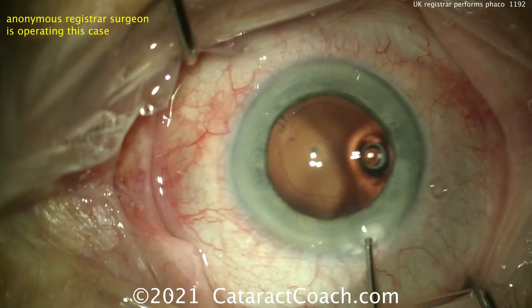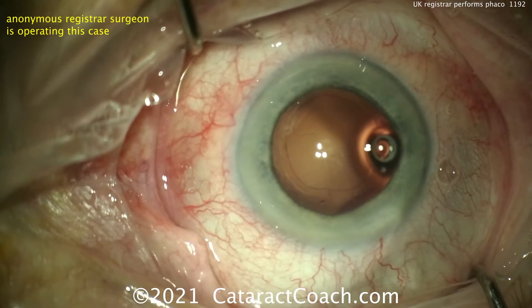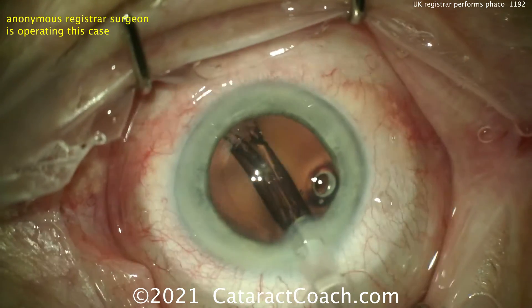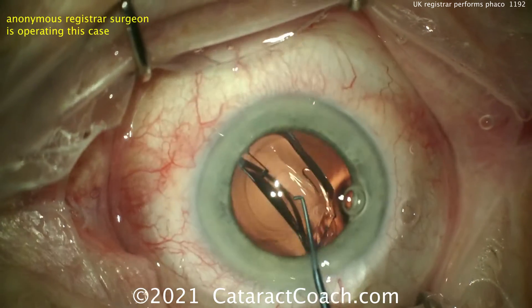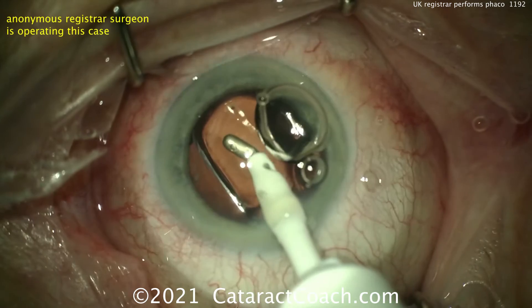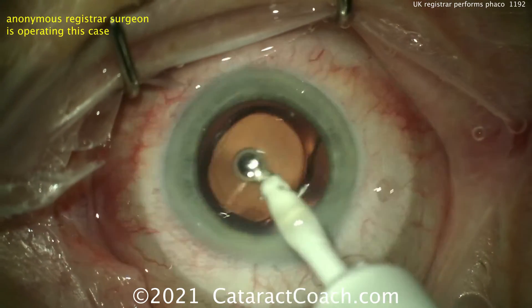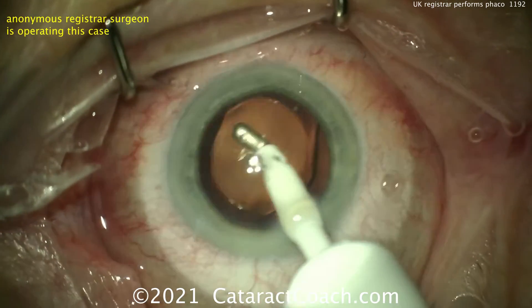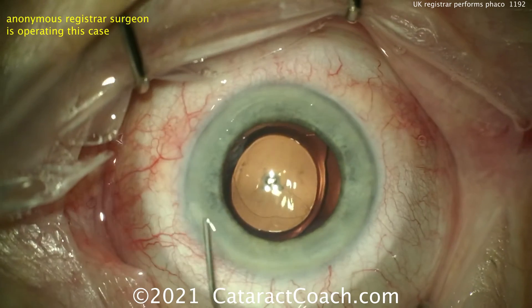So usually for doctors in training, for this registrar, I'm guessing we're going to get a single-piece acrylic lens in the bag. Filling up the capsular bag nicely with viscoelastic, then inserting the lens. In our program, I have our residents load their own lenses — I don't let the scrub tech do it for most of them, because it's an important skill to learn. There comes the lens going inside the eye — single-piece acrylic, looks pretty good, unfolding nicely, and getting positioned. Looks like a Sinski hook — make sure that opens up beautifully in the capsular bag. Now taking out the viscoelastic. You can see that incision — it's a little too avascular for my taste. I'd prefer to hit those limbal vessels just a little bit; it'll be better long-term sealing for the patient. I don't want chemosis or to cut the conjunctiva, but if you barely nick those limbal vessels, I think you'll agree it'll be nicer long-term sealing. That lens is definitely in the bag. You can see the difference in the rhexis we talked about earlier — a little bit small in the superior part.